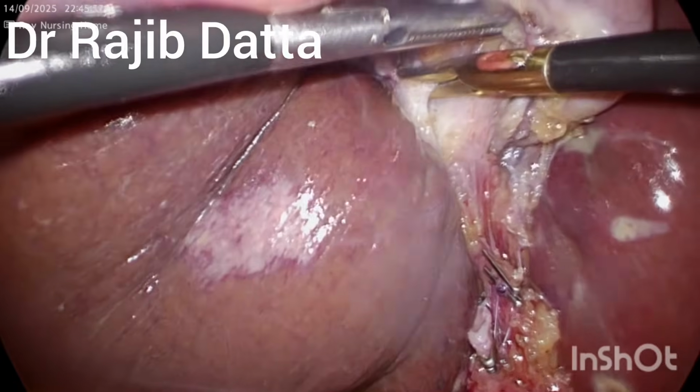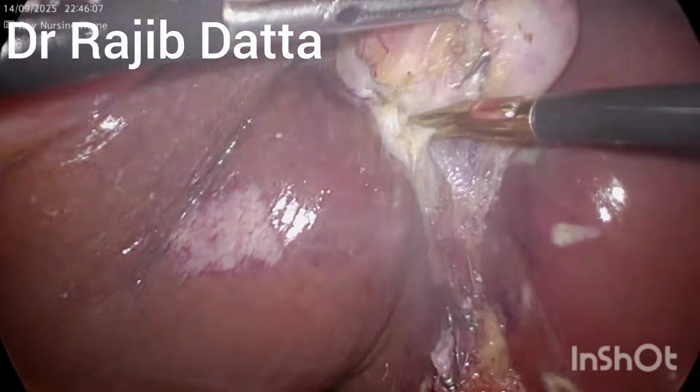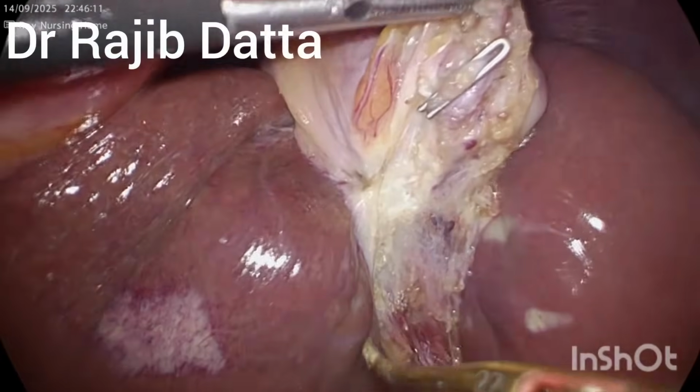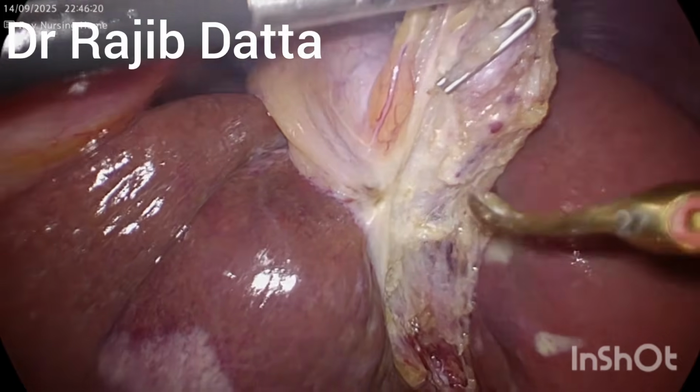So small bursts are going on, and the gallbladder has been separated out from the gallbladder fossa of the liver in a bloodless manner.